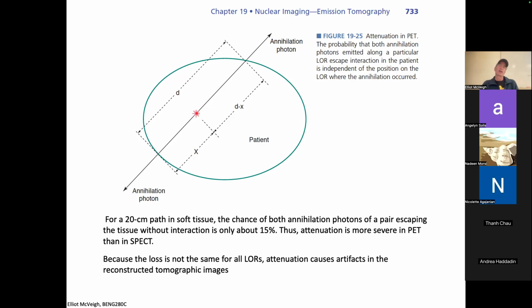Well, the timing: say I'm here and I have an event, my photon will hit this detector sooner than it hits this detector. In most systems, those two numbers are so small you can't detect the difference, and so they're simultaneous. It doesn't matter for most systems. Some systems do try to measure that time difference, with enough precision to get you within like 1/5 of the line or something like that. It's pretty fast, right? Just do the speed of light over like half a meter. It's like a nanosecond or something.